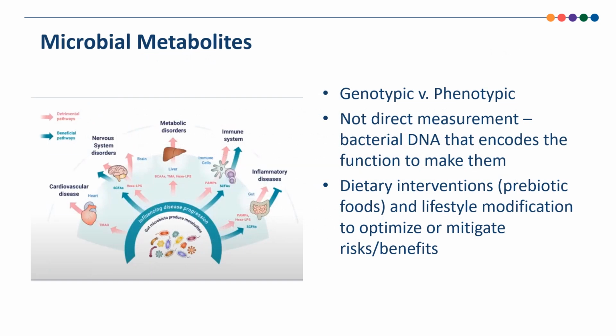We are looking at the genetic or genotypic potential of organisms to produce either beneficial or harmful metabolites. We are not measuring the metabolites themselves, which would indicate the phenotypic expression. Although we do have testing to directly measure some of these metabolites, such as our GIFX comprehensive stool profile. The good news is that we can influence the microbial genome composition and expression with diet and lifestyle interventions to improve overall health.